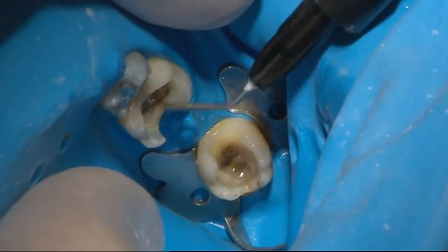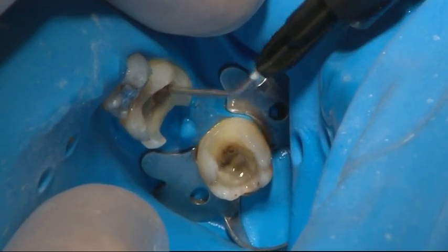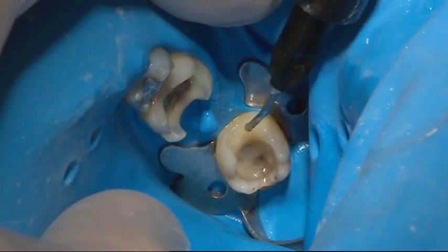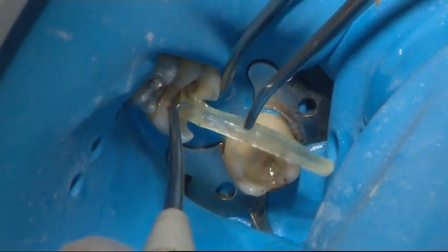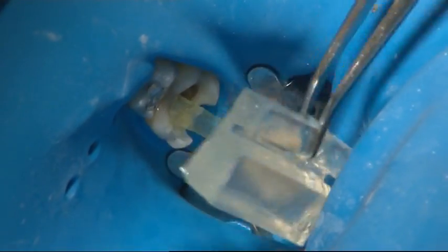A layer of flowable composite was applied onto the bonded teeth surfaces. The first fibre layer was placed on top of the uncured flowable composite and light cured for 5–10 seconds through the silicone adapter.